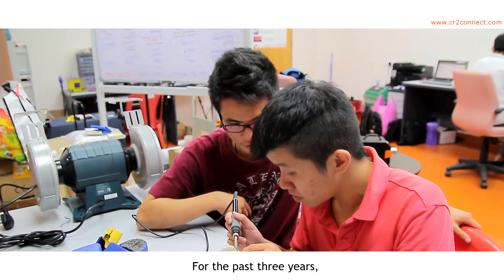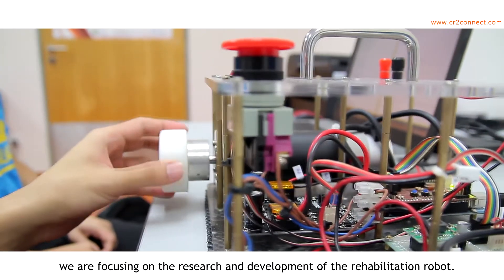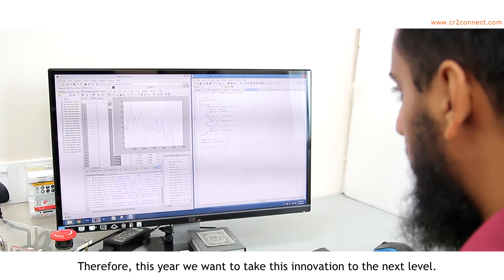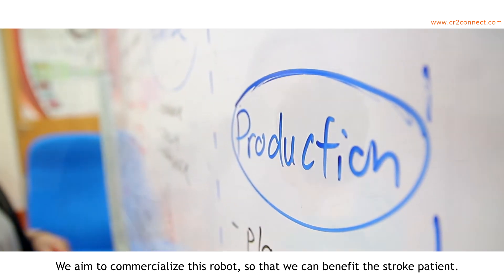For the past three years, we have been focusing on the research and development of the rehabilitation robot. Therefore, this year we want to take this innovation to the next level. We aim to commercialize this robot so that we can benefit stroke patients.